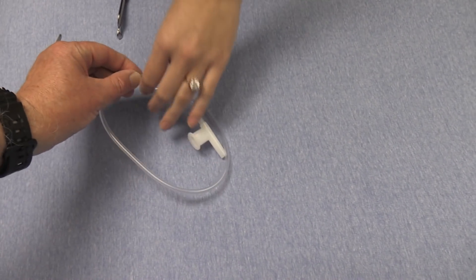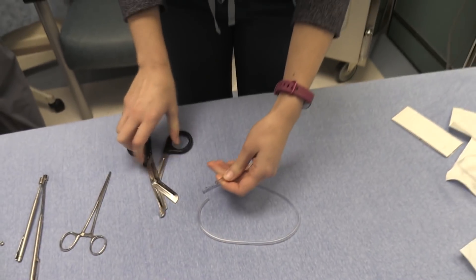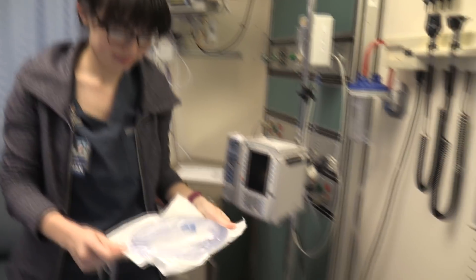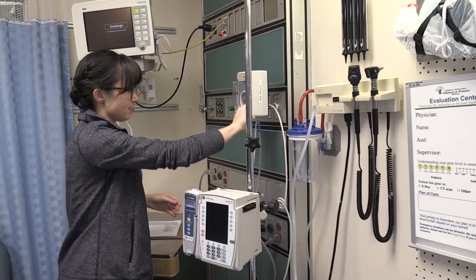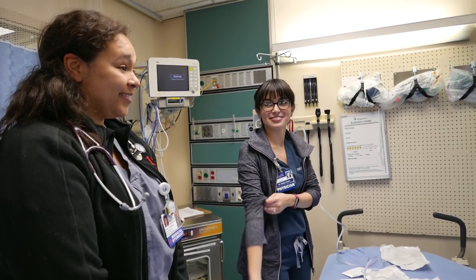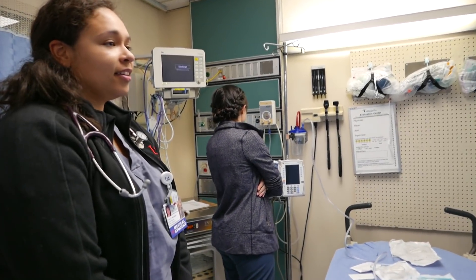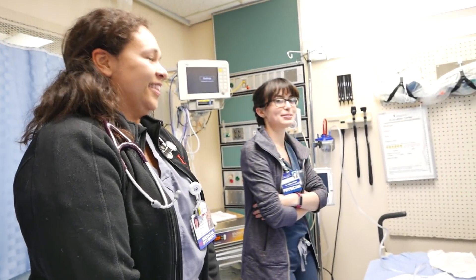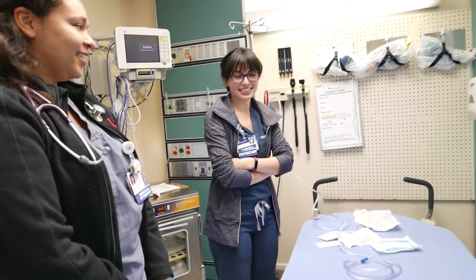We'll cut it off right about there. So you're going to set up the suction tubing there. Katie's a pediatric intern, and Perrin's a medical student, fourth year — she's an acting intern this month. The emergency department is very slow right now because it's three o'clock in the morning, so we have to do something academic here.